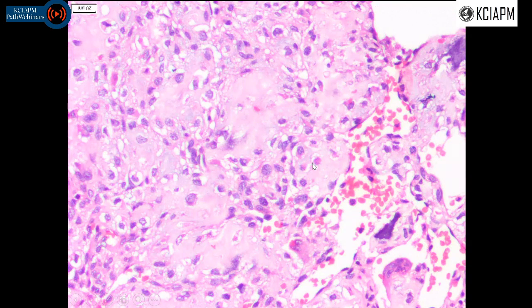Going closer to these cells, they seem large, polygonal. They have a vesicular nucleus. Some of them are round, some oval, some polygonal in shape, some elongated, and they seem to have grooves. Here we have giant cells, and here are blood spaces. So, okay, their diagnosis was ABC.